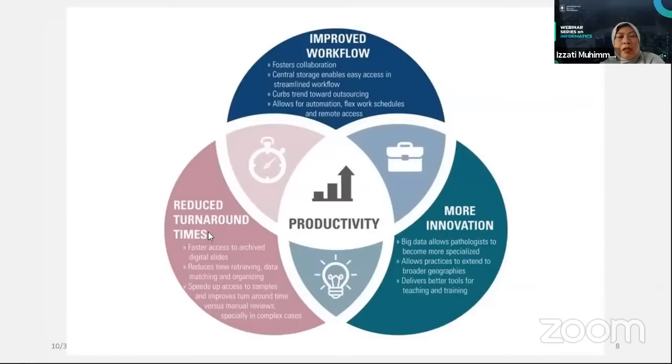And then it reduces the turnaround time because of faster access to archived digital slides. So if we want to compare with past data, it's easy to do. It also reduces the time spent retrieving data, matching and organizing, speeds up access to samples, and improves turnaround time versus manual review, especially in complex cases. What this means is that sometimes the quality of staining is not that good.